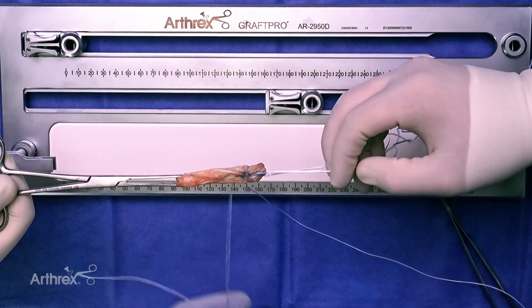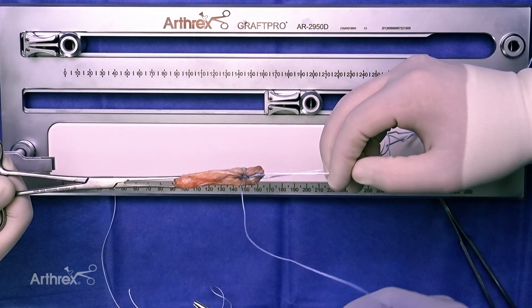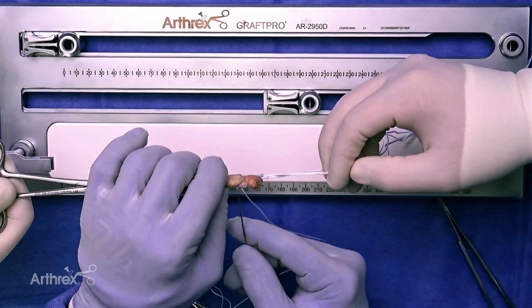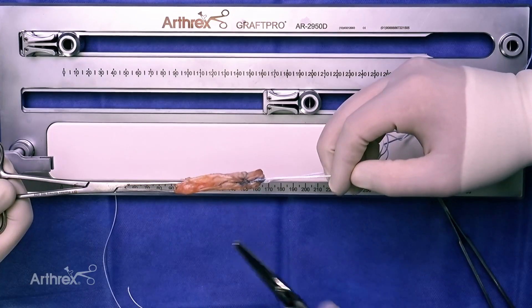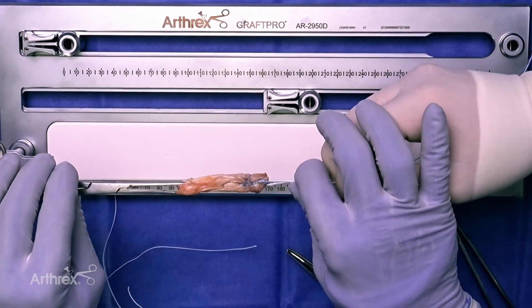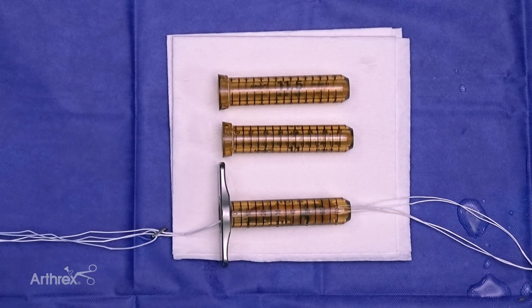Once we have tied to complete graft fixation, we cut one limb, retain the needle, and bury our knot. We have now completed the bone plug portion and will work on the soft tissue portion. The knee has been prepared for ACL reconstruction by doing a limited notchplasty. The femoral and tibial sockets have been created, and the fiber stick and tiger stick have been passed.